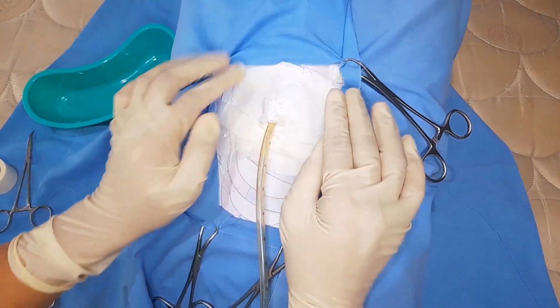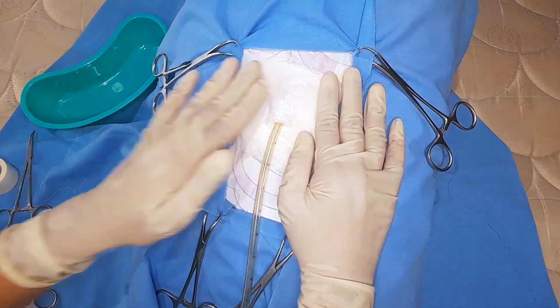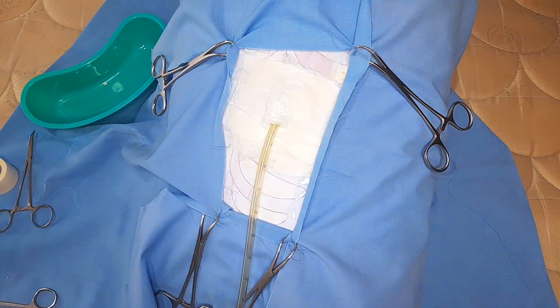Have the patient take an X-ray to ensure the correct placement of chest tubes.